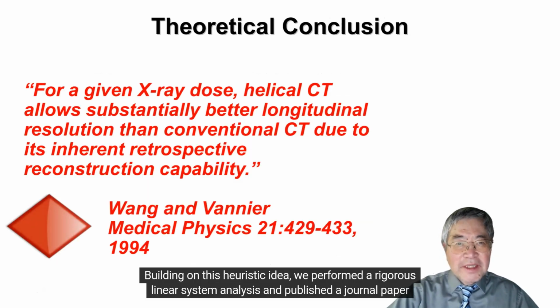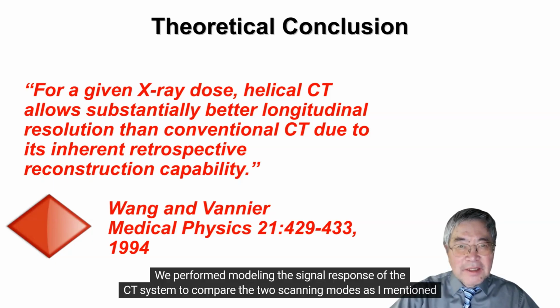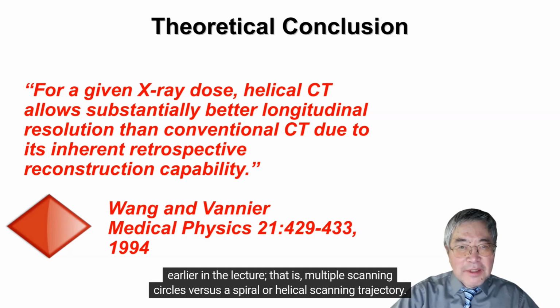Building on this heuristic idea, we performed a rigorous linear system analysis and published a journal paper in Medical Physics. We modeled the signal response of the CT system to compare the two scanning modes, as I mentioned earlier in the lecture. That is, multiple scanning circles versus a spiral or helical scanning trajectory.